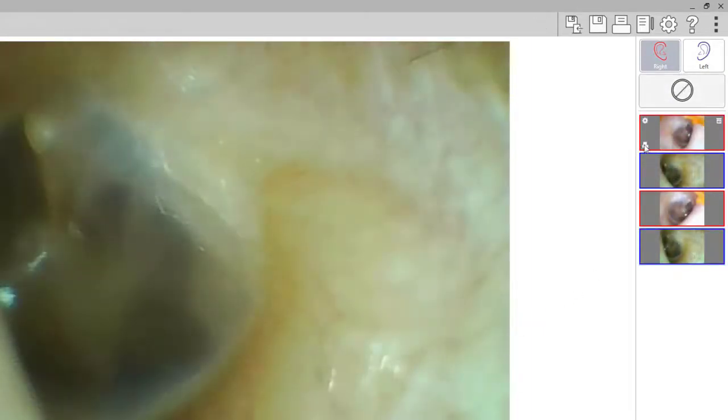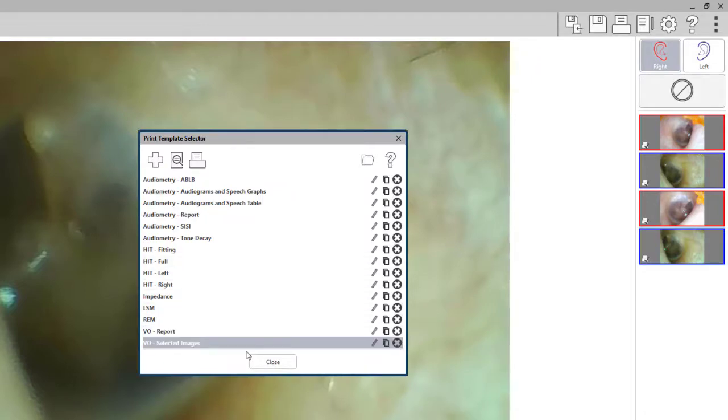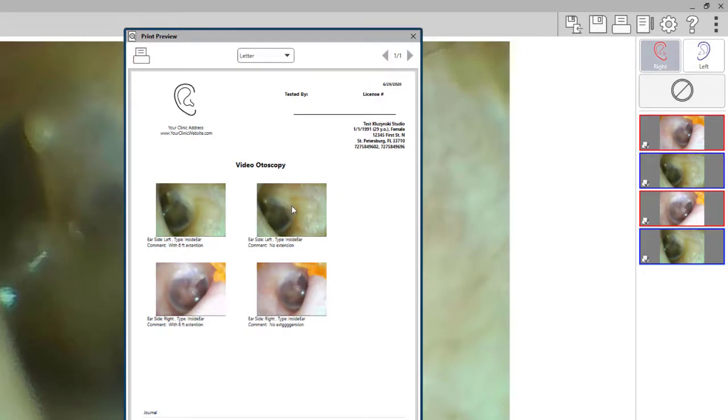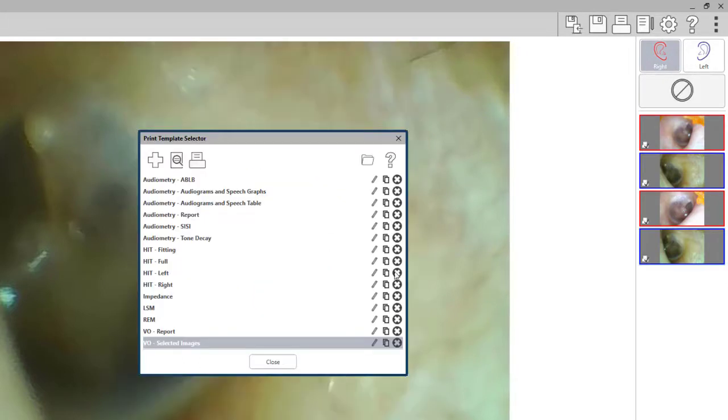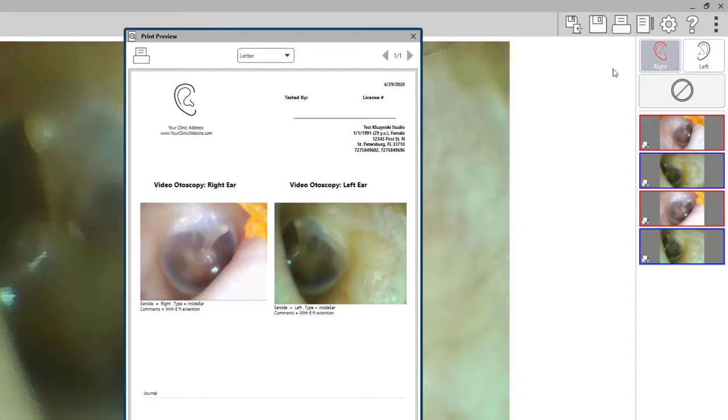For example, if we select all of the photos to show on the template, when you click on the print icon and you select your template, you will see that all four images that were selected are shown. If you would like just the individual images, you can see that the last one on each side and each type will show on your template.